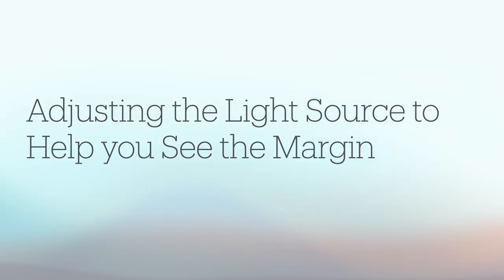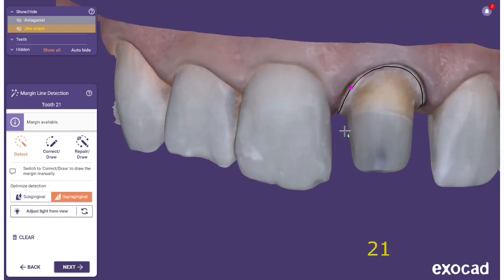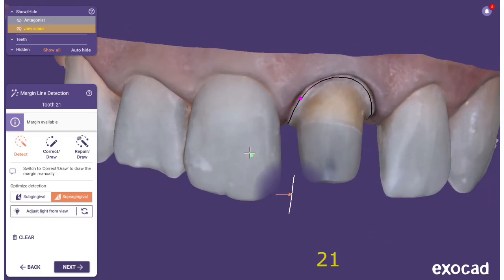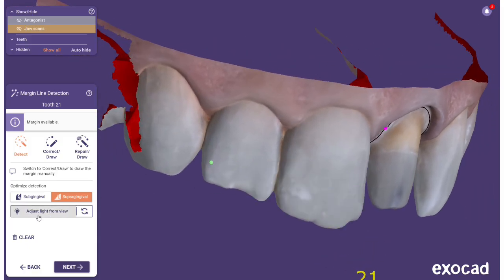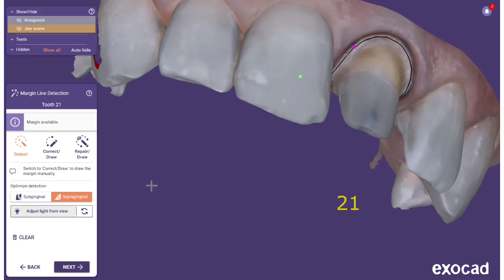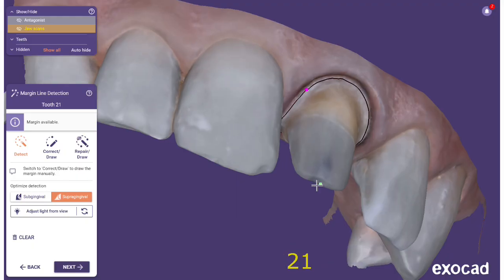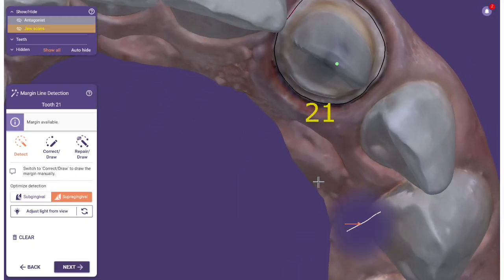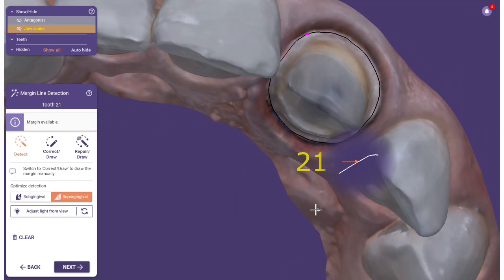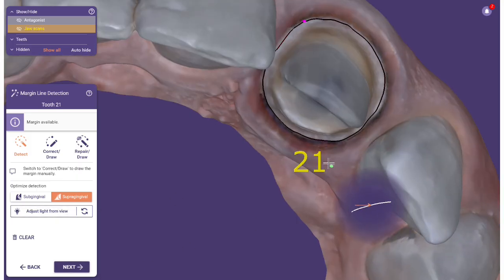Adjusting the light source helps you see the margin. You can rotate the project so that you look at it from the insertion axis, then click Adjust Light From View to adjust the virtual light source so that it comes from that viewpoint. If you look at the margin from the side afterwards, the shadows will help you see the margin.